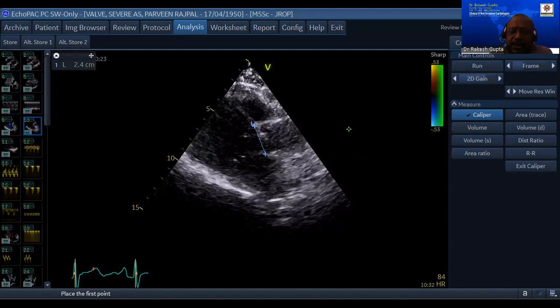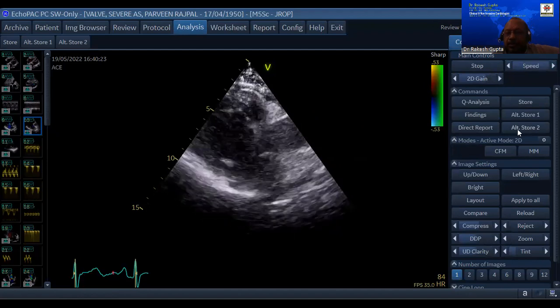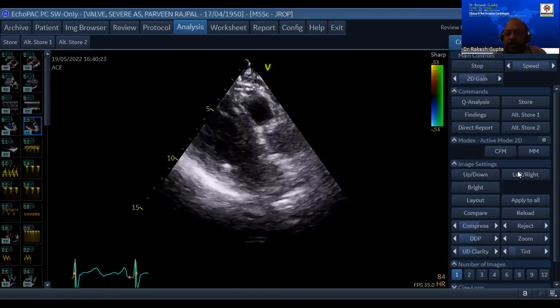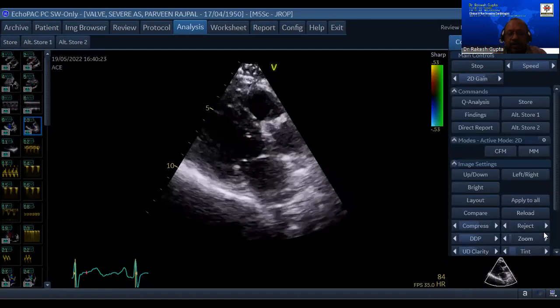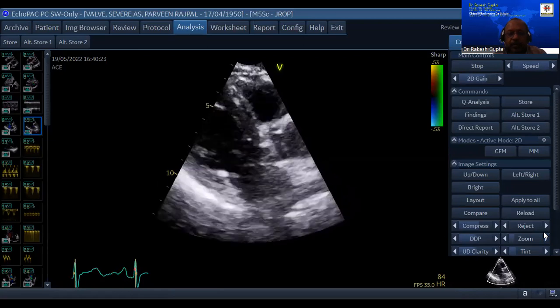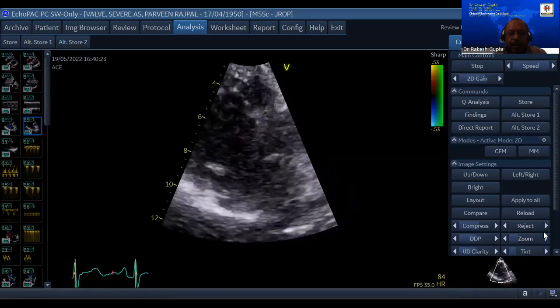And what we have been teaching now to a large extent is that you zoom up this picture. So let's play and zoom up this picture. Run. I'm going to zoom it up for you now. Can you see it better now?